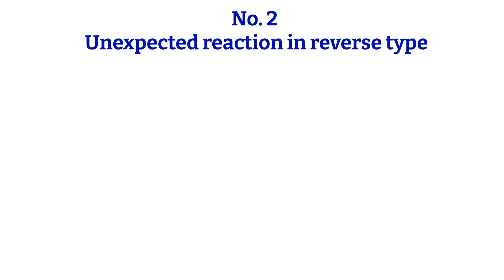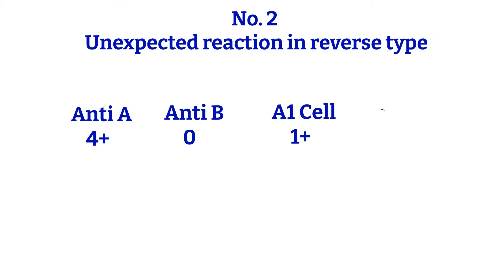Moving on to the next example — Number 2: unexpected reactions in the reverse blood type. For example, Anti-A 4+, Anti-B 0, A1 cell 1+, B cell 4+. Looking at these reactions, what comes to your mind? I'll give you a few minutes and then we will talk about it.